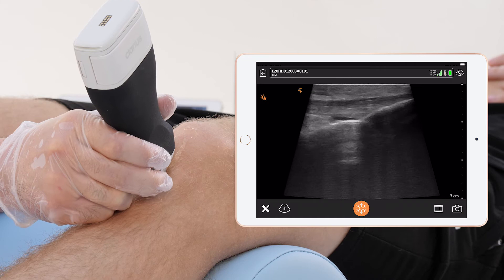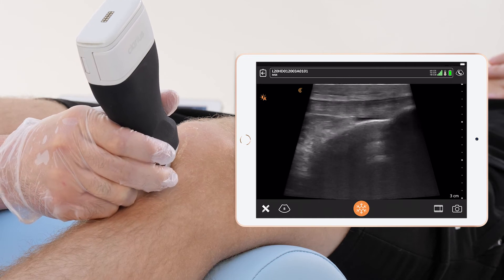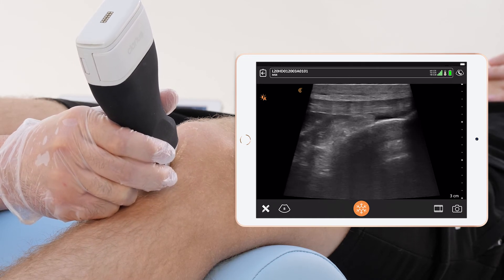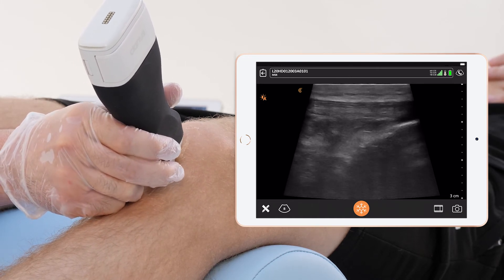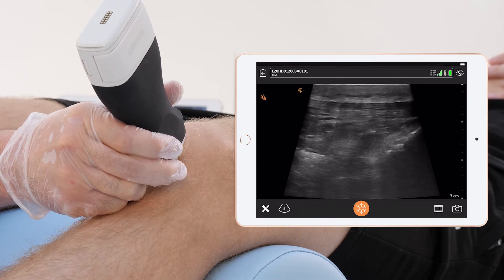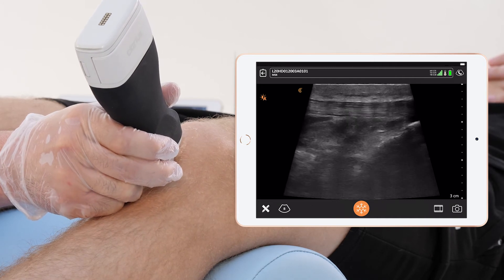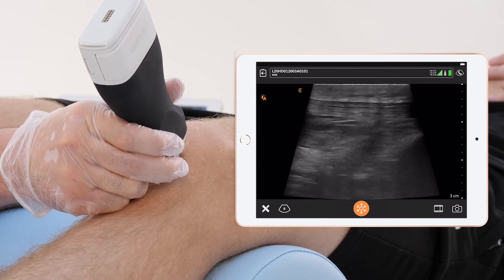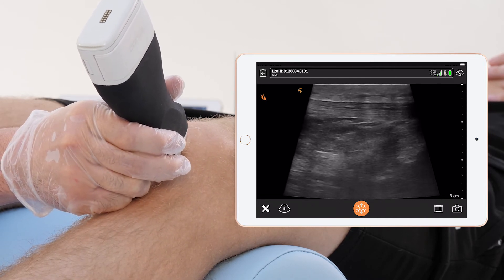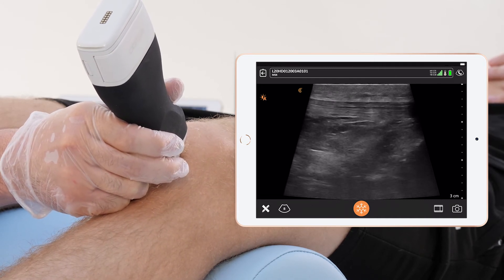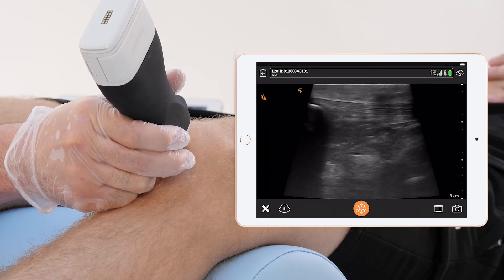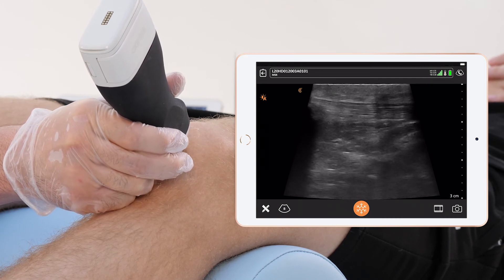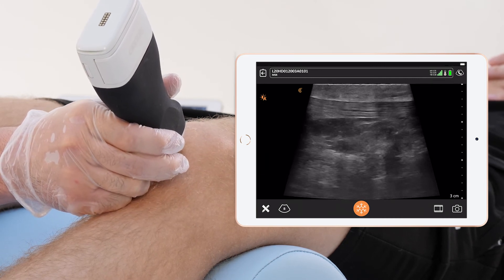We check the tendon for its shape — has it thickened or is it thin? We also look for echogenicity changes. Is there a tear? If yes, is it a full tear or a partial tear?